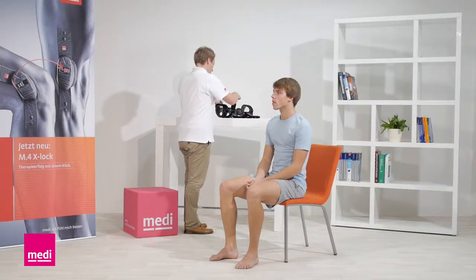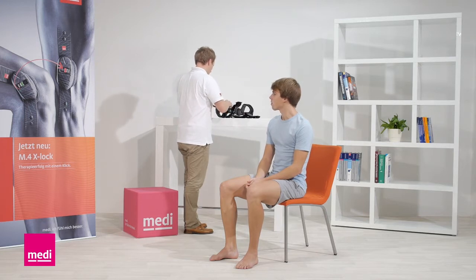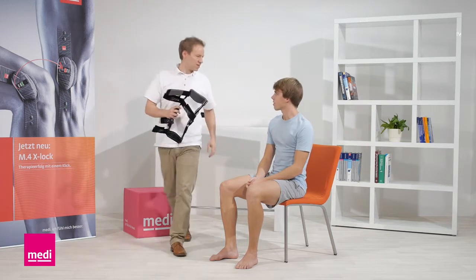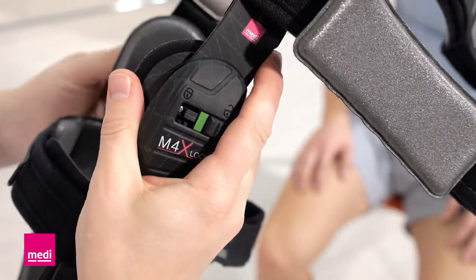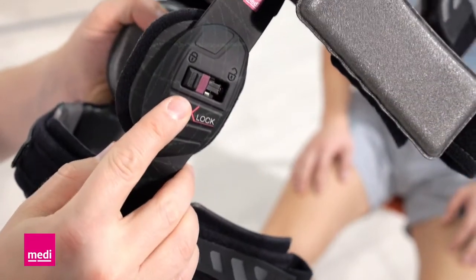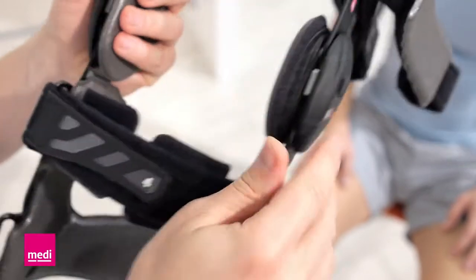The orthosis should be worn directly next to the skin to ensure the best possible fit. Whenever possible, put the M4 X-Lock on with the legs straight. Straighten the orthosis and lock both hinges by pushing the slider bar forward. The red box is then shown in the windows on the hinges.